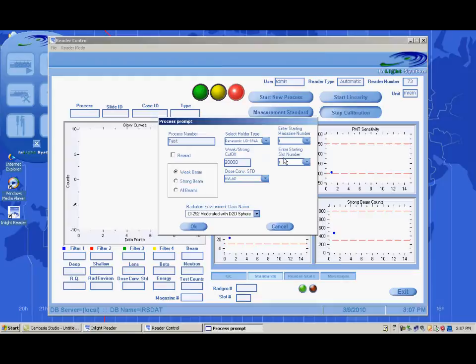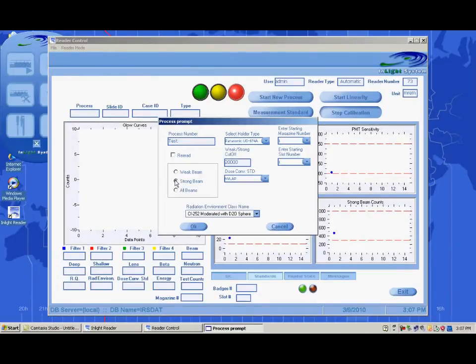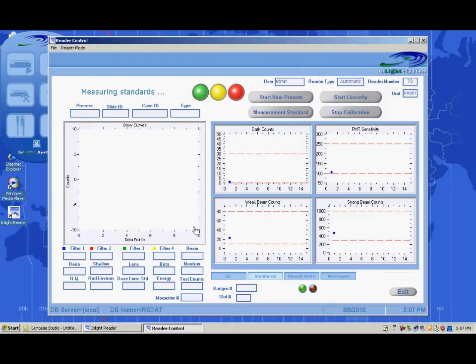Enter the process information and select the beam to be calibrated. Landauer's standard calibration set includes 0, 500 millirem and 10 rem to be used for the strong beam calibration, and 0, 50 rem and 500 rem doses to be used for the weak beam calibration. As with all processes, the reader will first perform a standard measurement test, then load the magazine and read each dosimeter.